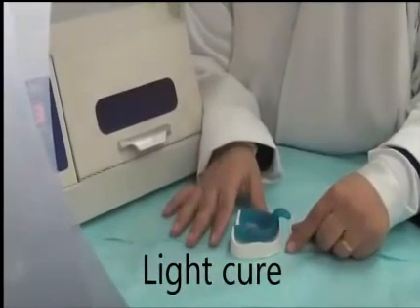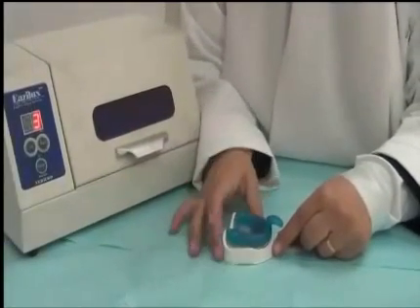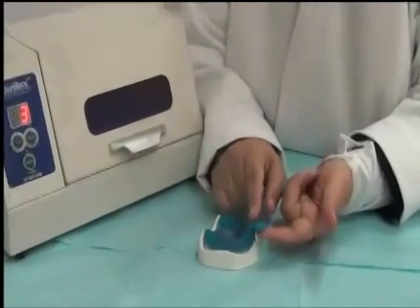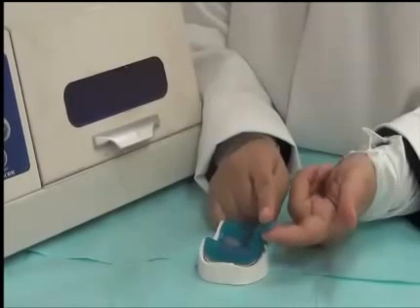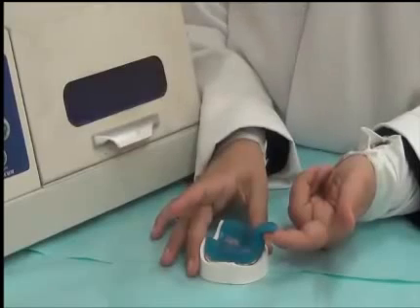So now we're ready for the light cure. Once we place it in the light cure, this is what we said about the handle. Sometimes it slumps down. So we need to put it back, and when we put it in the light cure, we're going to support it by using that.